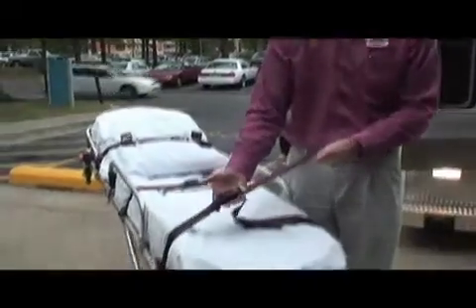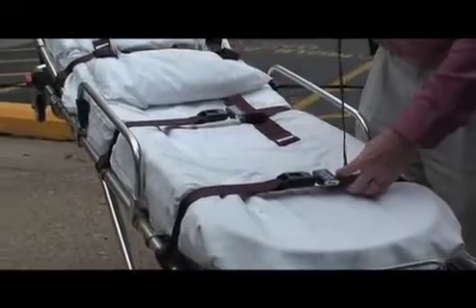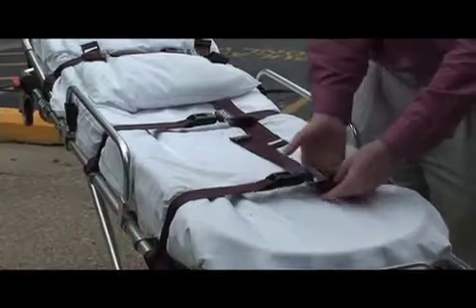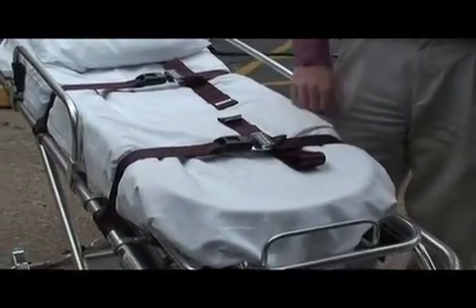Put the strap in as normal, tighten it down, okay? Then you're going to make a triangle. Hold at the tip here, pull the strap up to the top, and then just come through halfway, okay? And it makes a nice clean 90 degree.